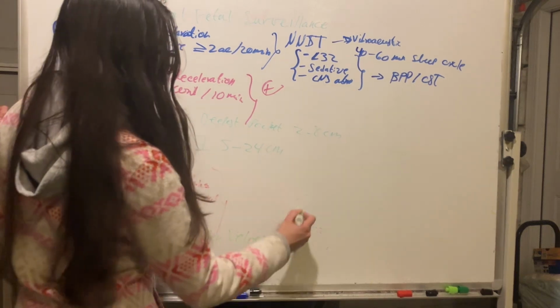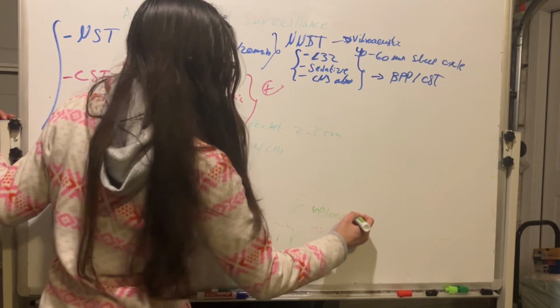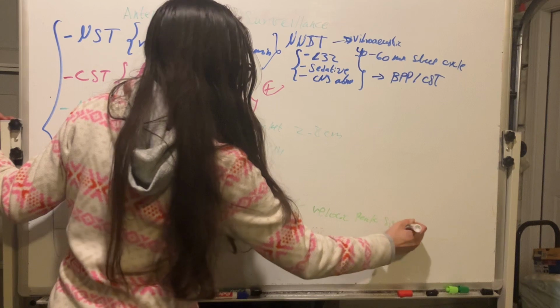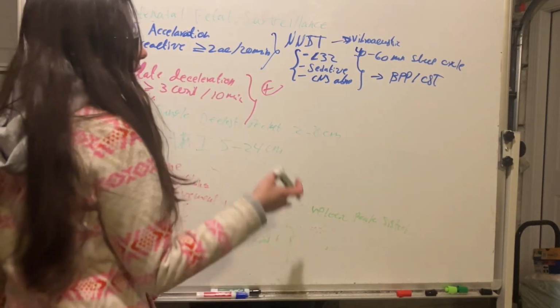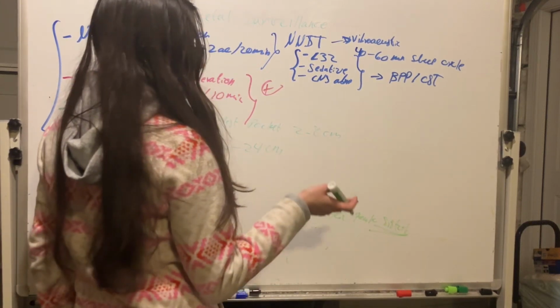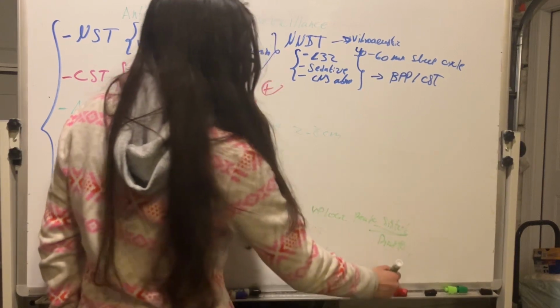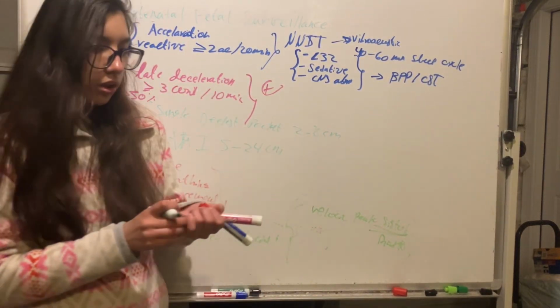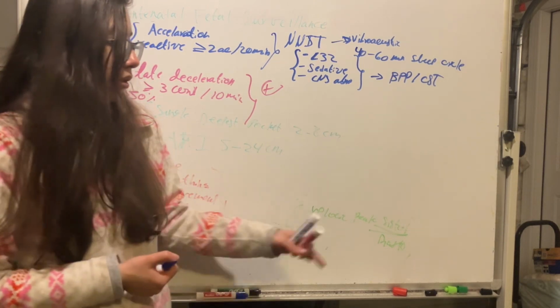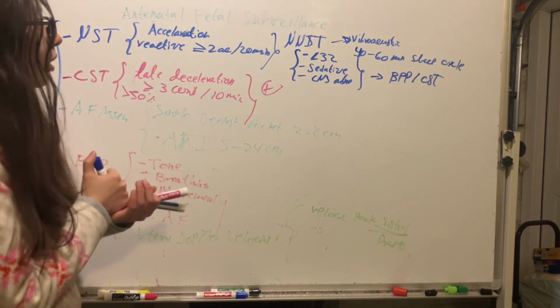So here we evaluate the ratio of the peak systolic velocity, or the peak velocity of blood flow during systole, divided by the peak velocity of the blood flow during diastole. In cases where there is no diastolic blood flow, or even a reverse blood flow, that's prompt delivery.